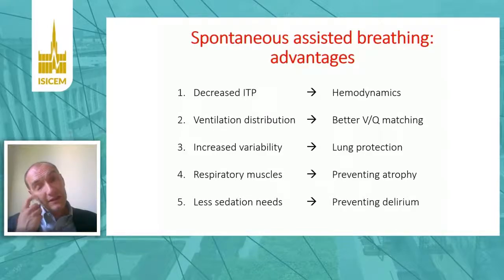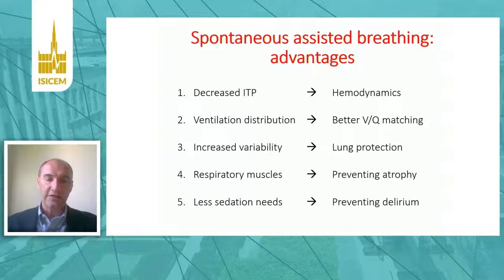So we know that spontaneous modes of ventilation have advantages. Hemodynamic advantages due to the decreased intrathoracic pressure, better distribution of ventilation, increased variability of ventilation, better function of respiratory muscles, and less sedation needs. So certainly being able to start and to properly set spontaneous modes of ventilation has advantages for the patient.